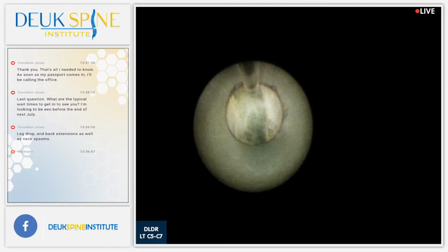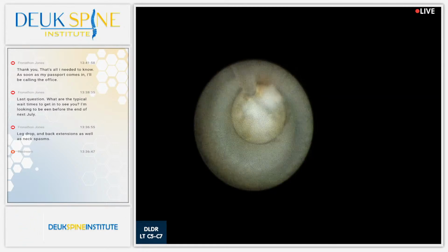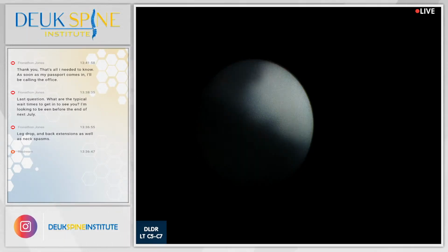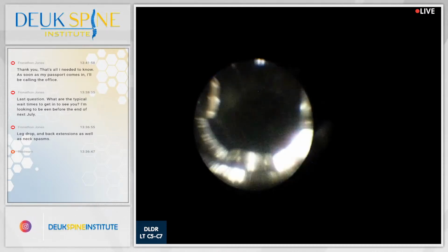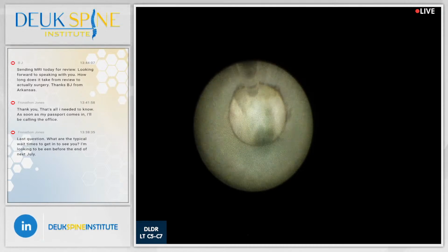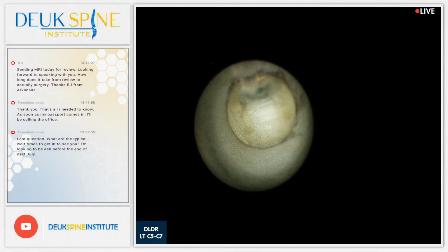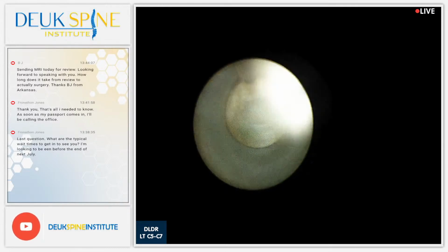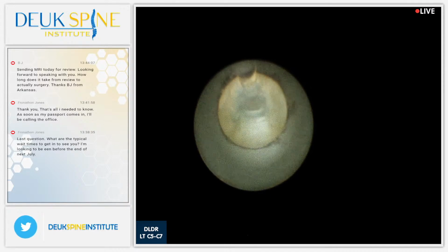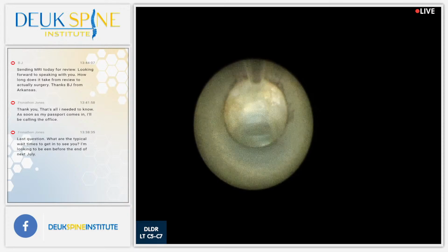All right. Looking good. Maybe a little bit right here. Like the never-ending herniation. That's it. Let's float it out. So what I'm doing is once I get those pieces of herniation in the tube, I kind of raise the tube up and float them out of the body. That's one way of getting rid of herniations. If they're loose. If they're not loose, then you have to zap them with a laser like this, or you got to grab them and pull them out. Okay. Any other questions?